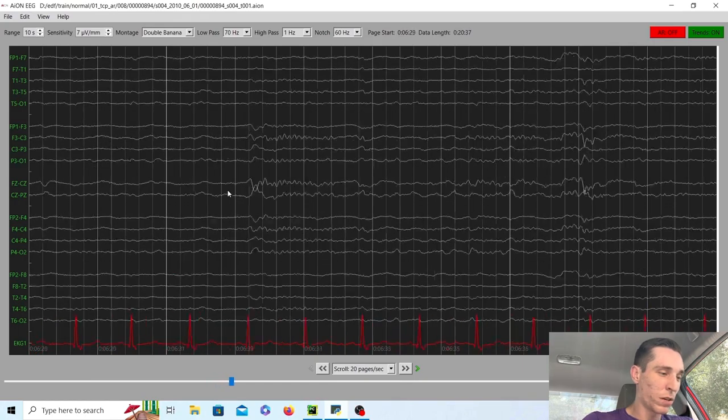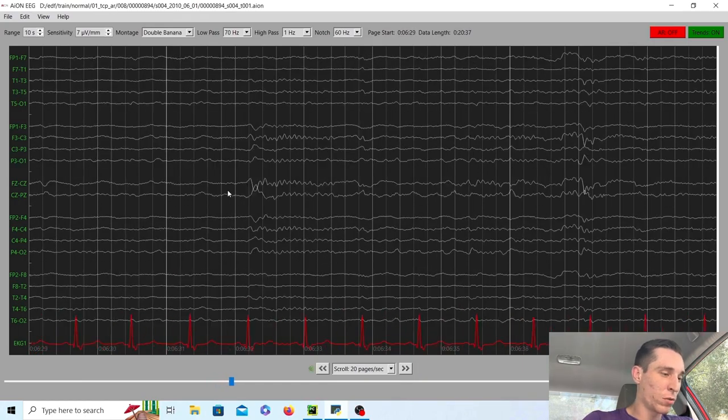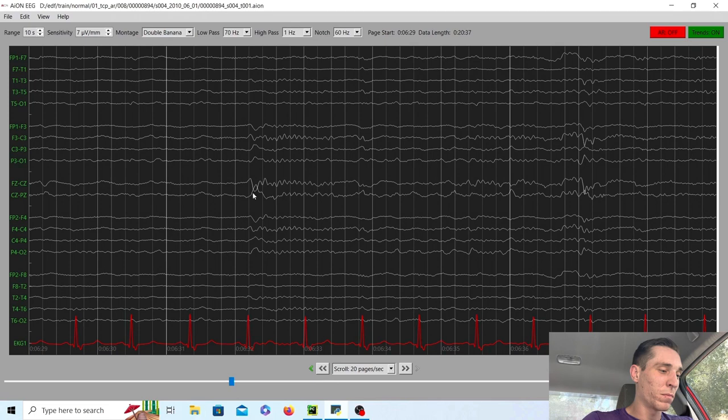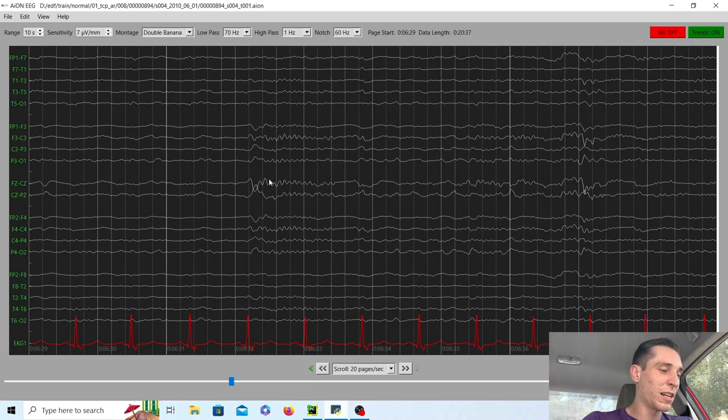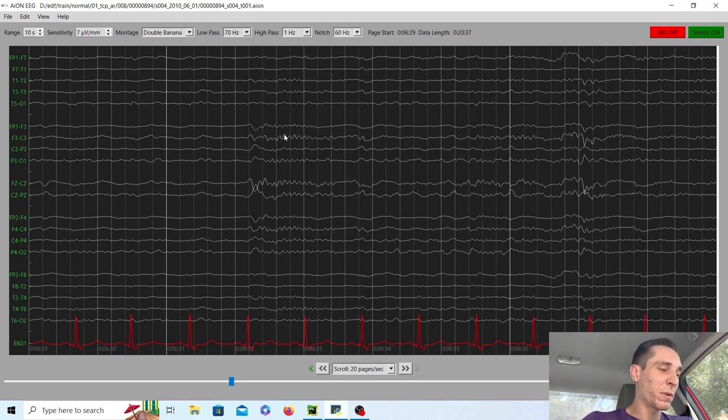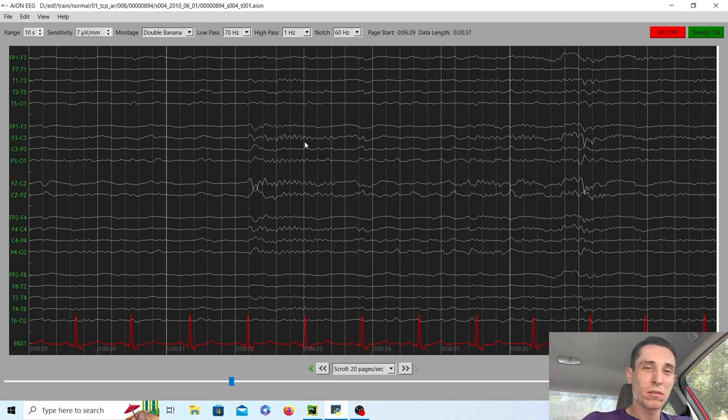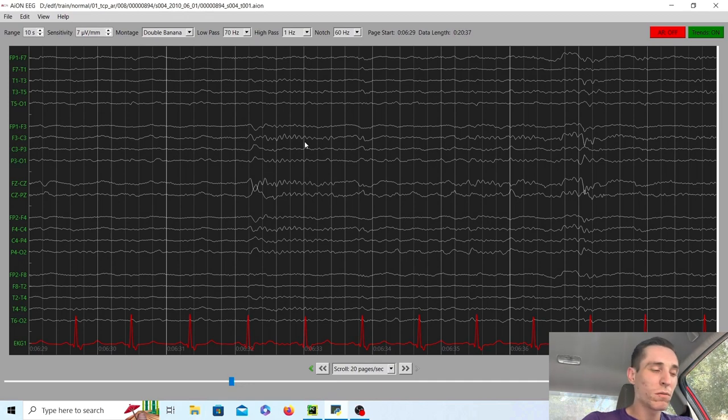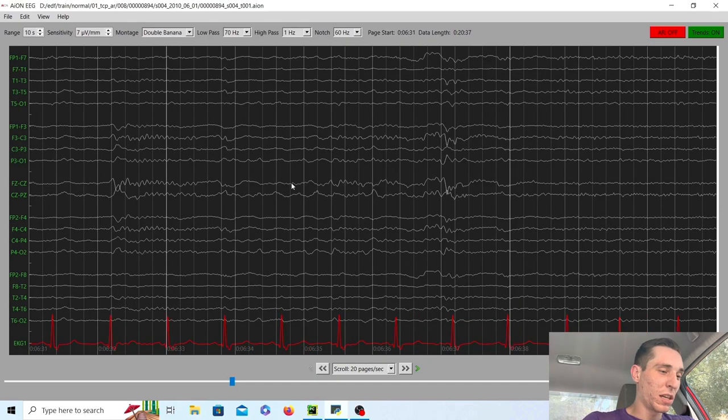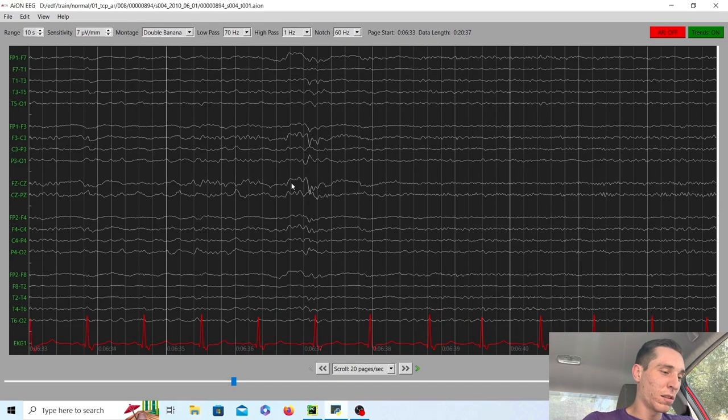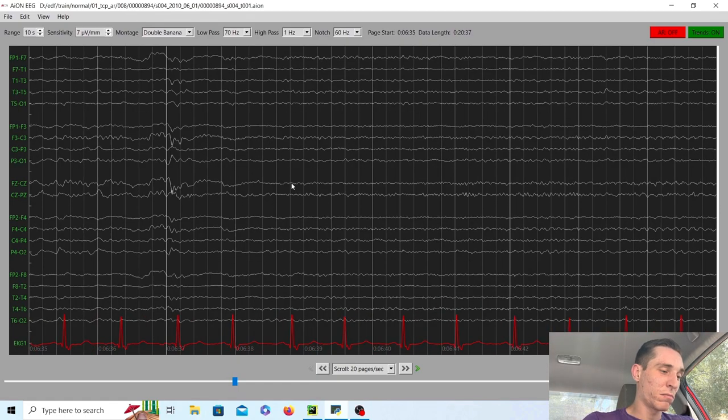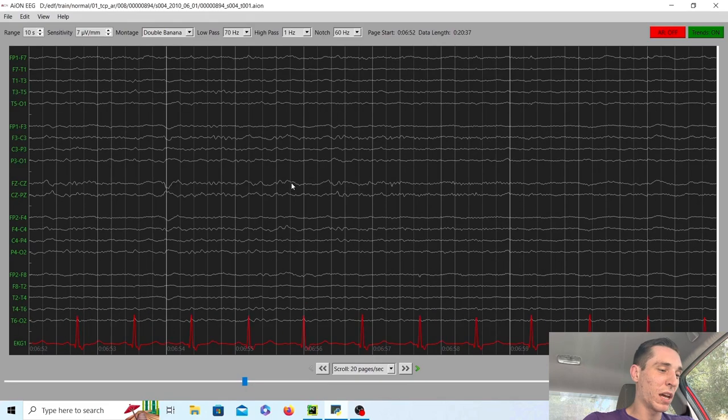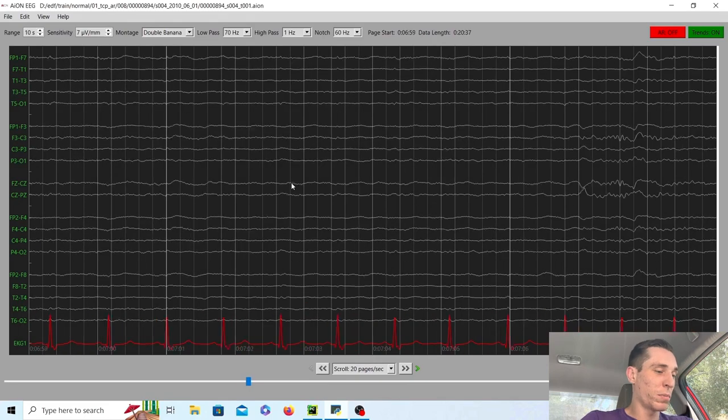Hopefully we will get to, oh, we got some vertex waves and it looks like some sleep spindles as well. So you got vertex wave and then this faster activity right here is the sleep spindles. And that's going to be usually around beta range. So maybe 13 waves per second. So we're starting to see the first transition into stage two sleep.